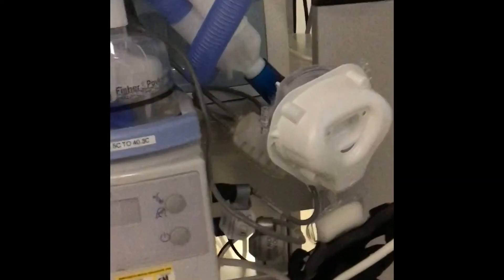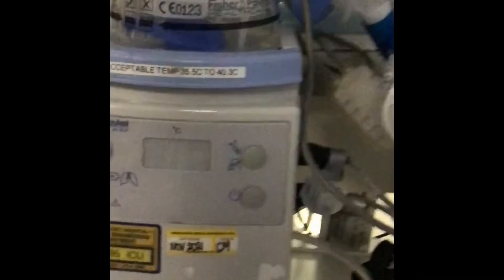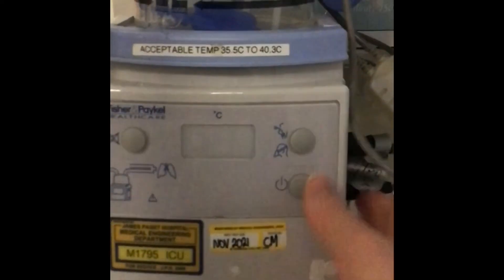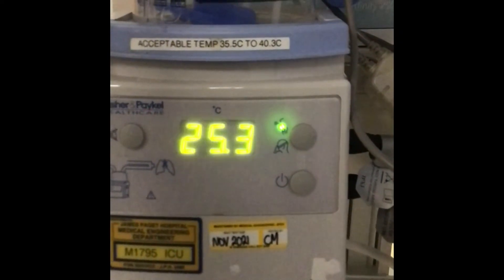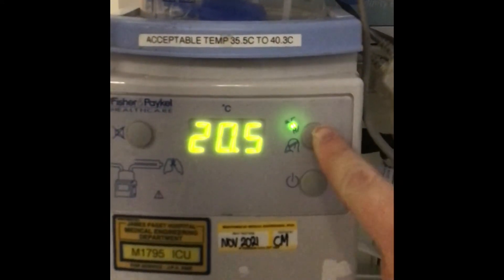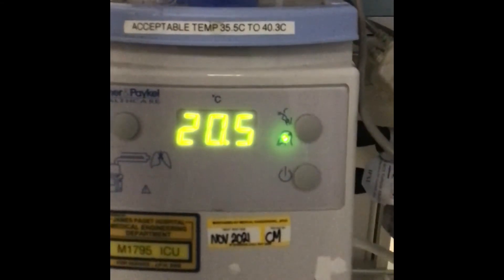The other thing you need to do is change your humidifier so that it's suitable for a face mask, to stop the mask from steaming up. To do that, turn it on and press and hold this button here until the light is on the face mask and not on the ET tube.